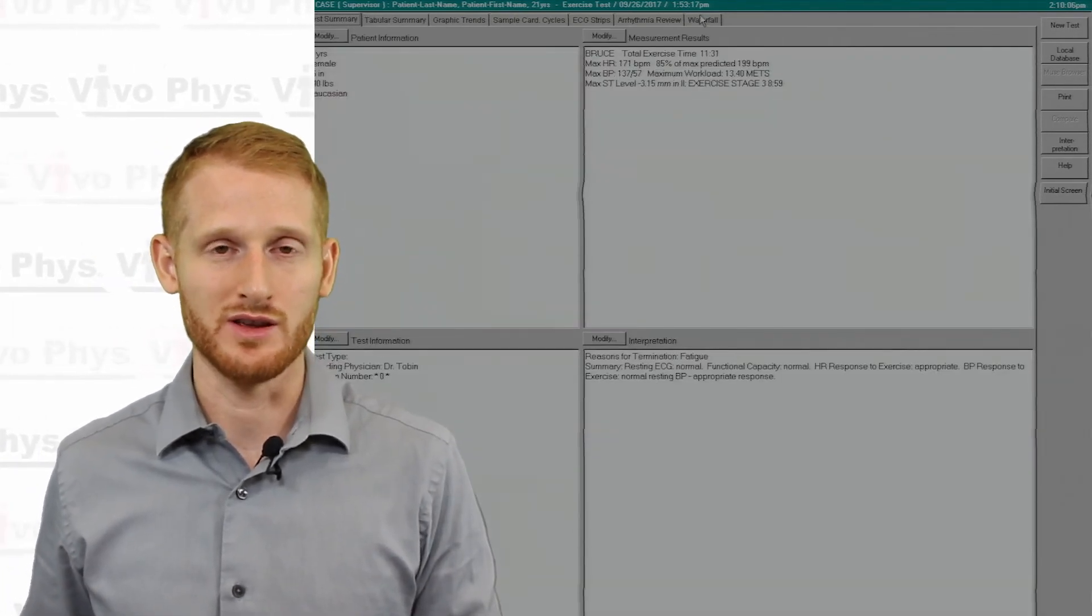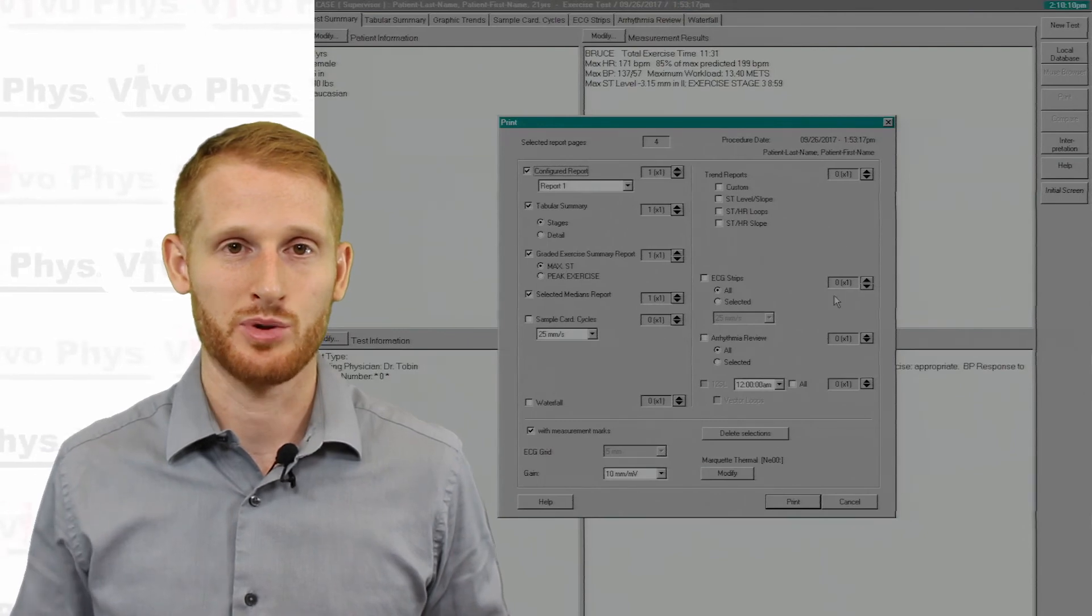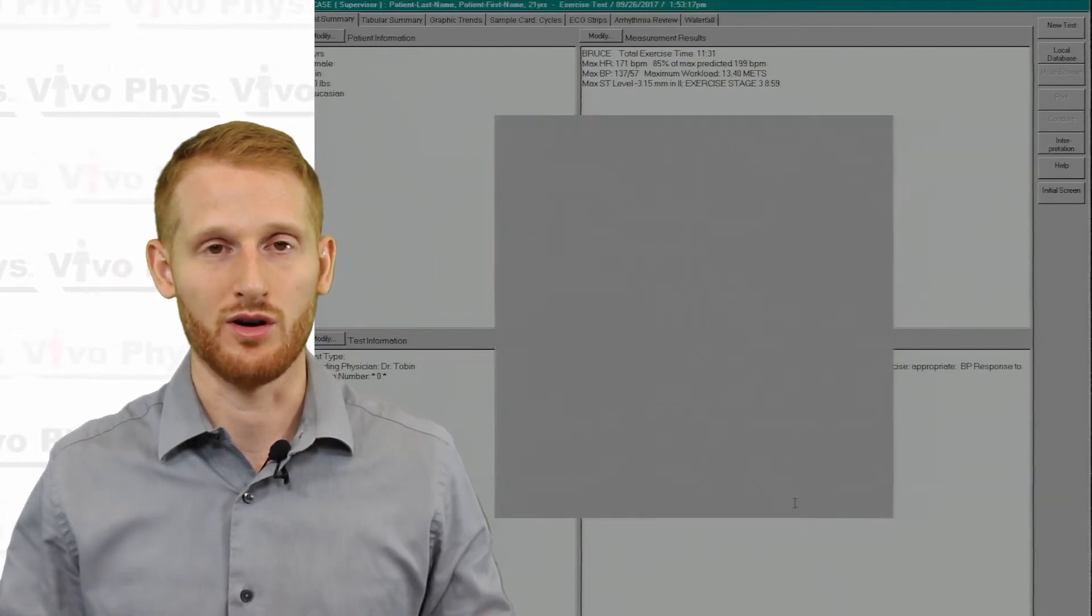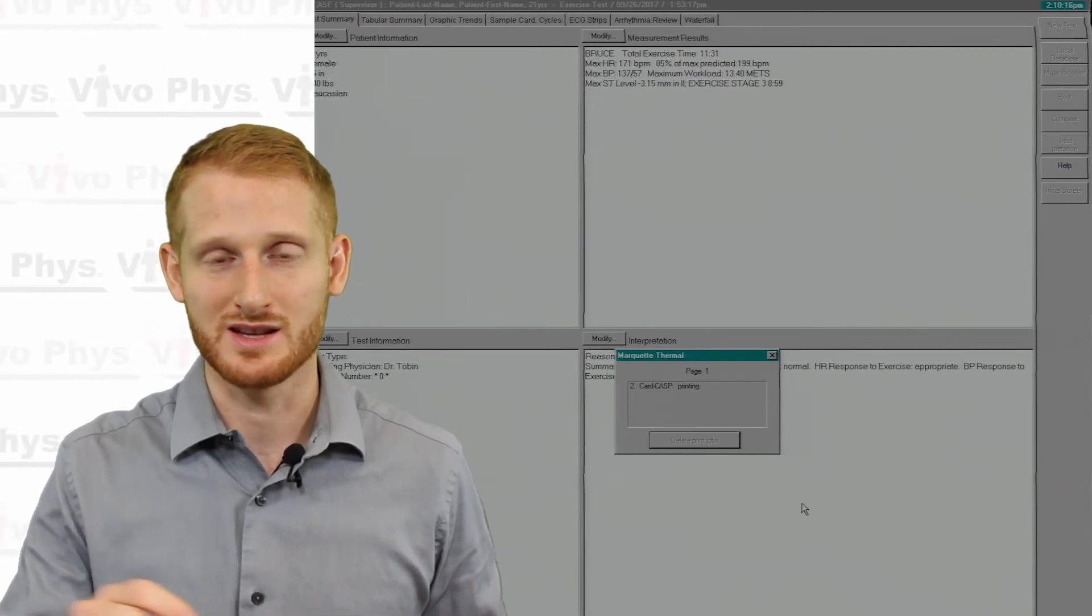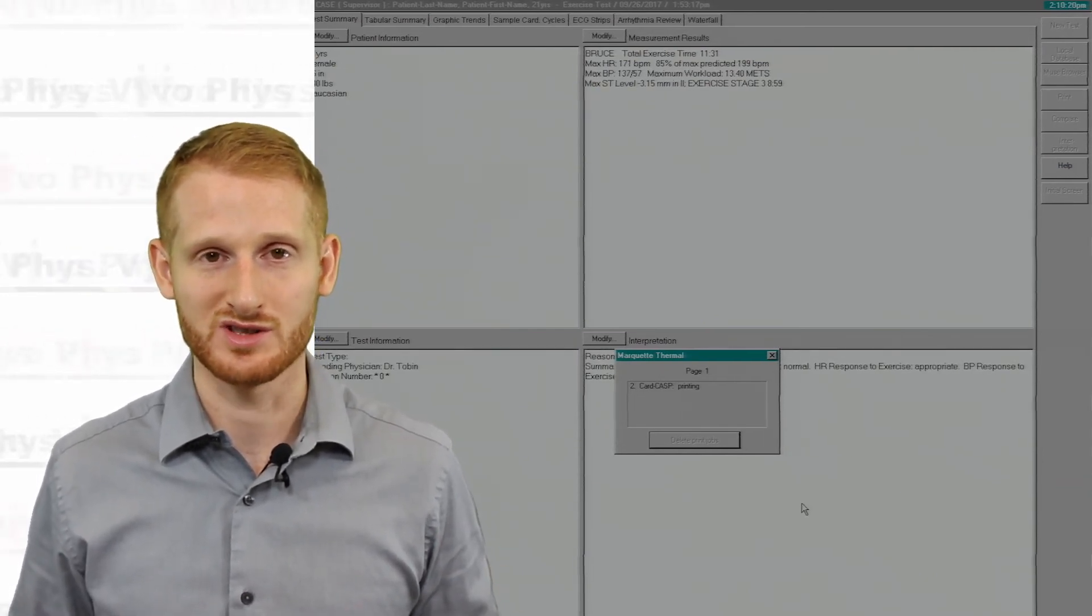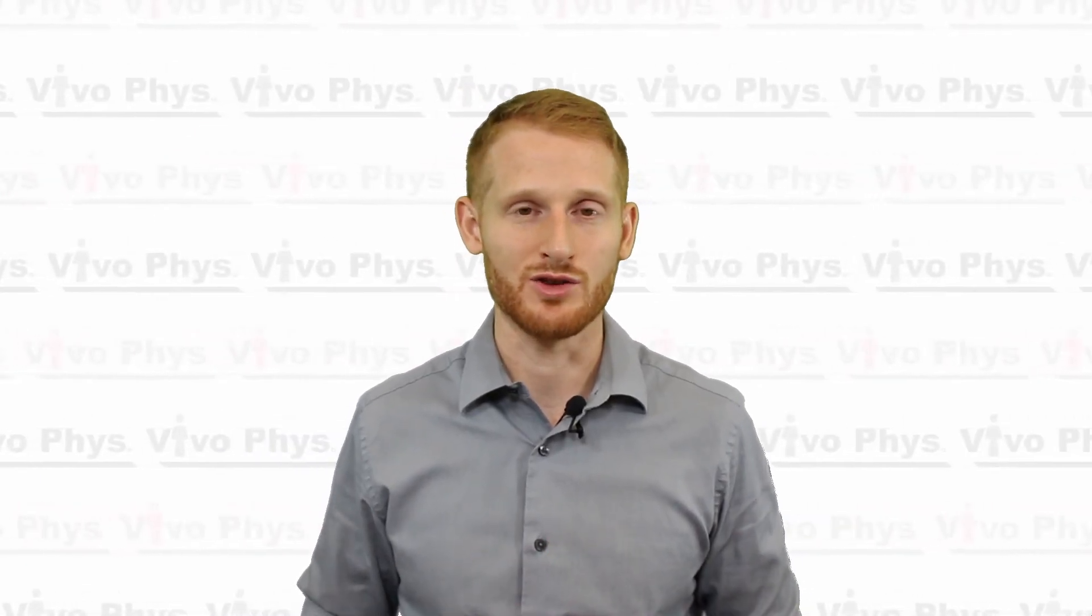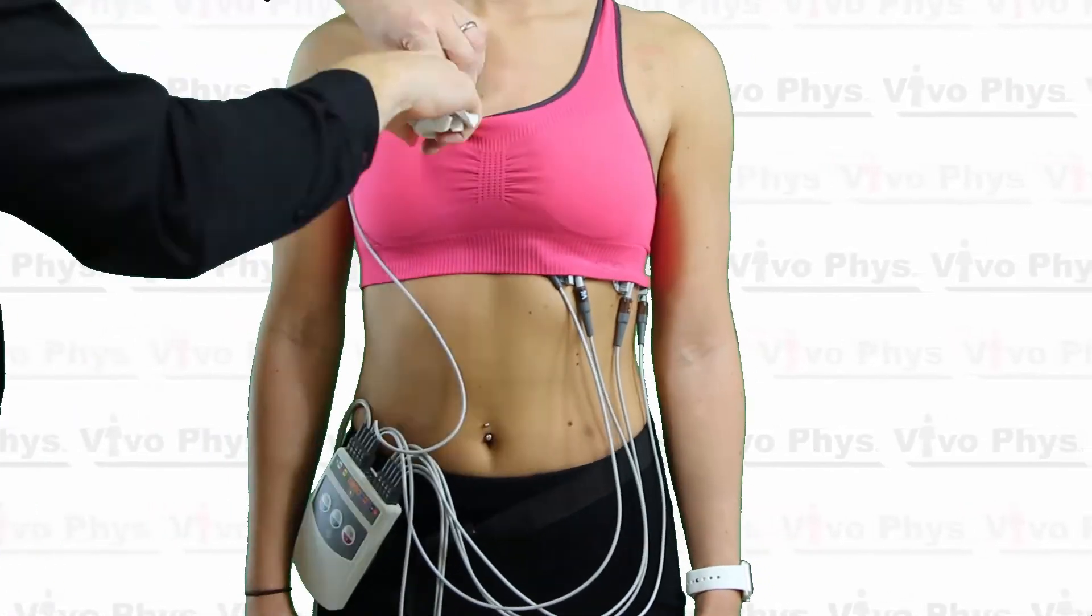Once you've printed off all the arrhythmias you're going to go back to the initial tab and you're going to print the sort of overall indications of the test. You can also print any of the other tabs but those are the two that I recommend at least doing. Once you've printed off everything you need, unhook the person, make sure they're unattached from the machine and just hit the initial screen button and that's going to get you back to the screen you saw when you first turned on the system.